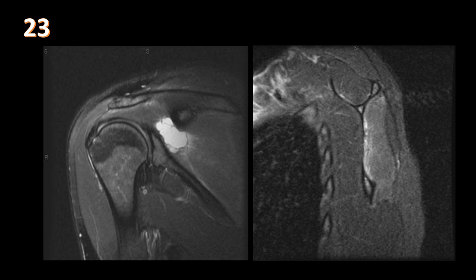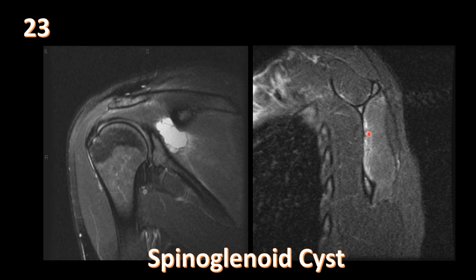Coronal oblique and sagittal oblique T2 fat-suppressed MRI images of the shoulder show a large paralabral cyst insinuating into the suprascapular nerve tunnel. There is edema of the infraspinatus only — the suprascapular nerve innervates both the supraspinatus and infraspinatus. A mass at the suprascapular notch would cause edema of both muscles; at the spinoglenoid notch, only the infraspinatus is affected, as in this case. Other causes of shoulder denervation include axillary nerve compression in the quadrilateral space and brachial neuritis (Parsonage-Turner syndrome).